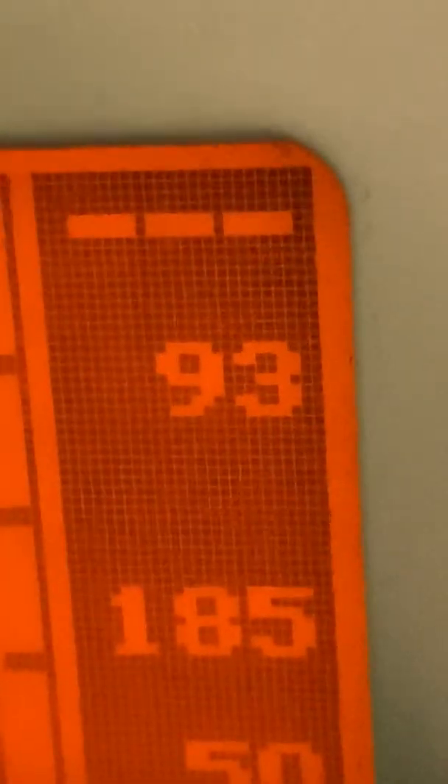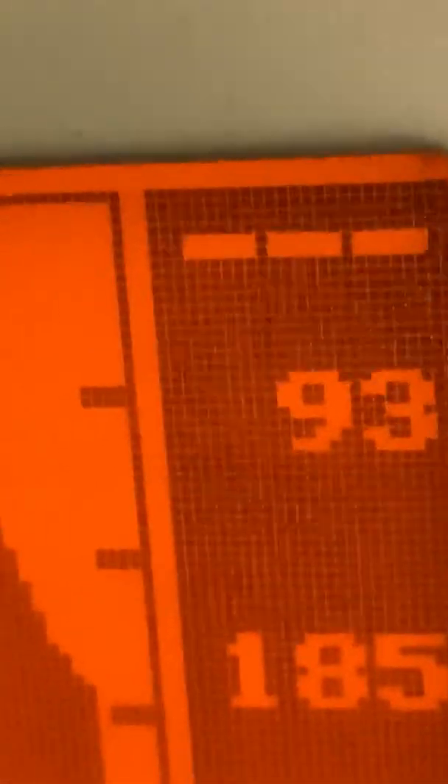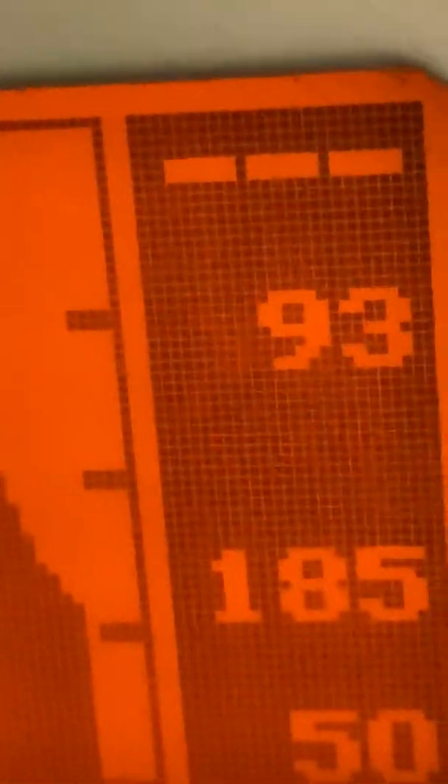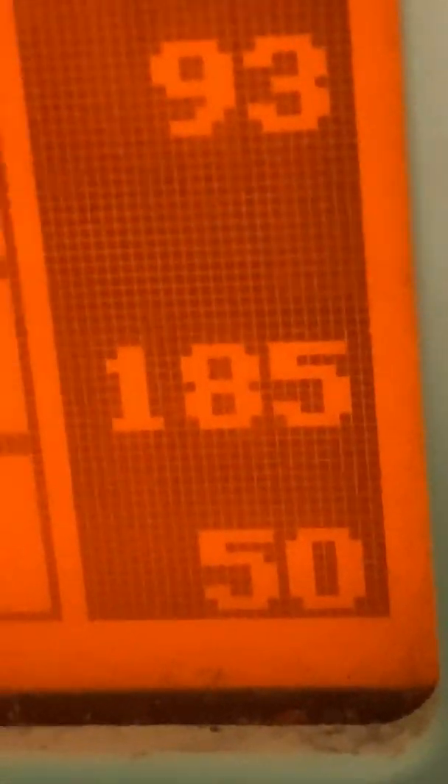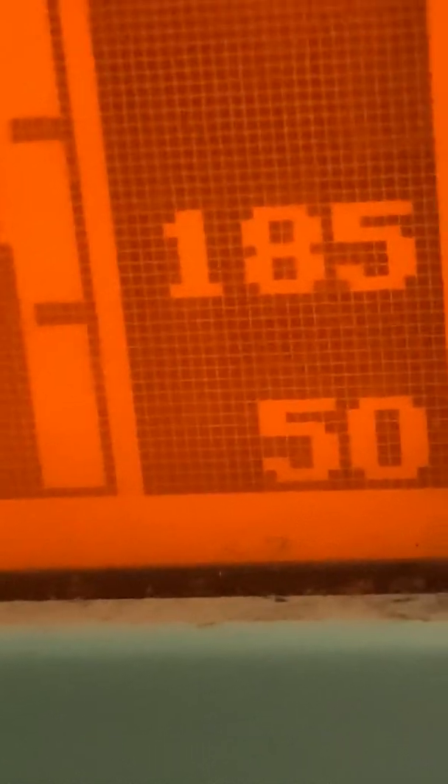These are the alarm limits. I have the high oxygen saturation alarm limit turned off, and the low oxygen saturation alarm set to 93. I have the high heart rate alarm set to 185, and the low heart rate alarm set to 50.